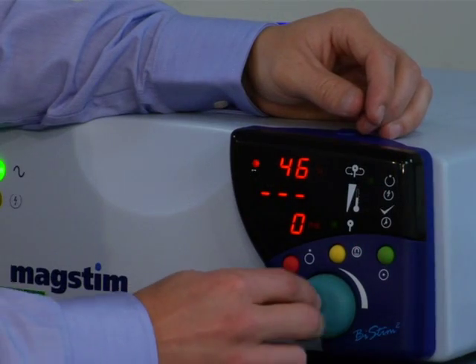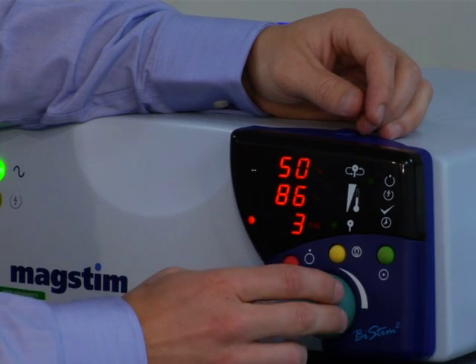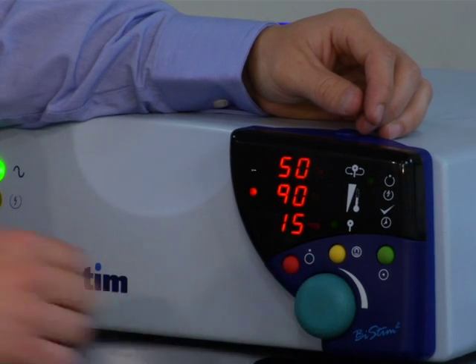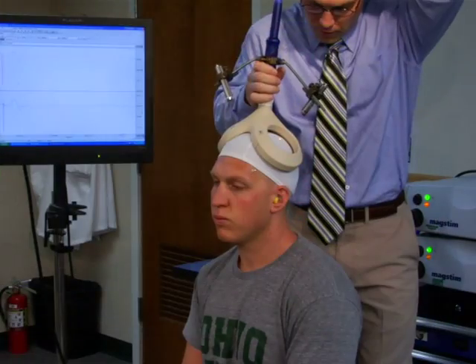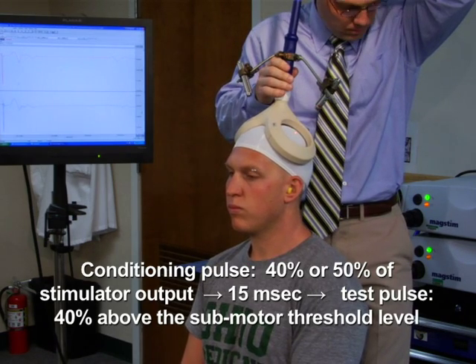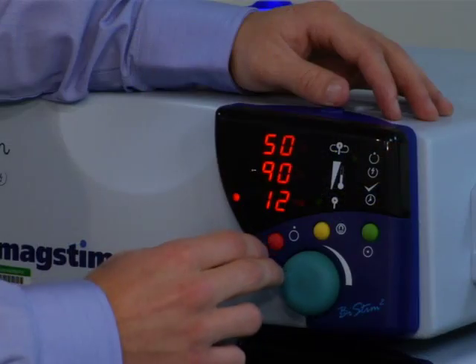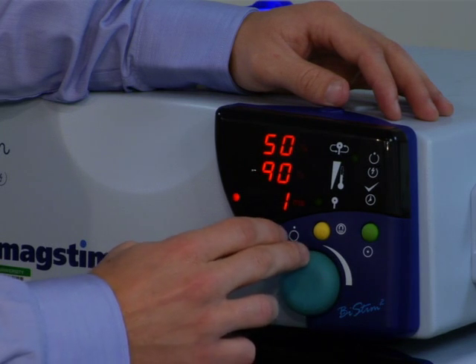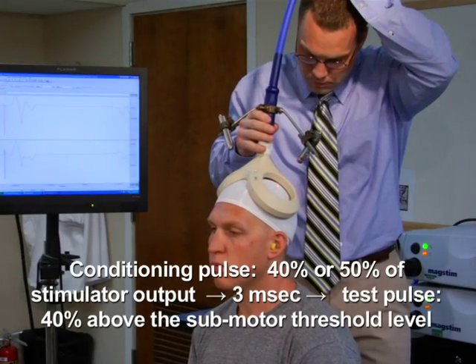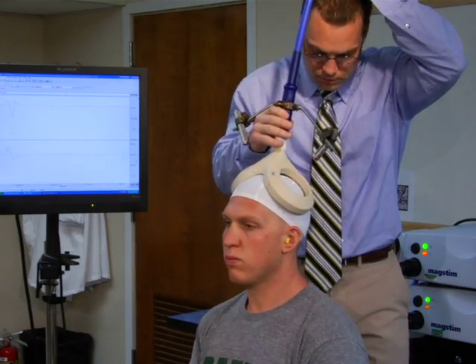To use paired pulse TMS to determine intracortical facilitation for the erector spinae muscle group, the conditioning pulse intensity should be set to the observed submotor threshold intensity — either 40% or 50% of stimulator output — and the test pulse intensity should be set to 40% above the submotor threshold level, being 80% or 90% of stimulator output. Next, to quantify short interval intracortical inhibition, use the same procedure as described for measuring intracortical facilitation, with the exception that the interstimulus interval between the two pulses should be reduced to 3 milliseconds.